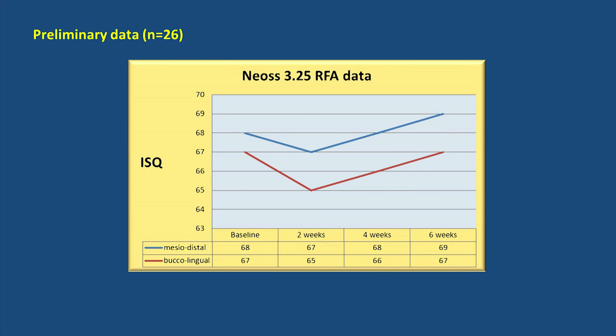And these are the preliminary data, and they show you this kind of drop in stability at 2 weeks. And it's very interesting to notice that the baseline value is comparable with that achieved with the standard 4-diameter implant.